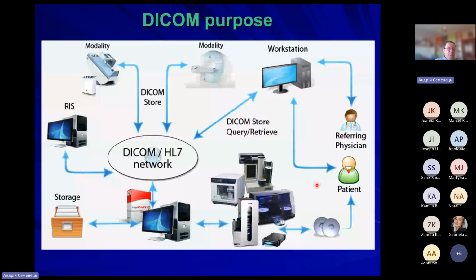And actually, DICOM ensures that no matter which vendor we choose to buy our diagnostic equipment from, no matter which model we use, they all must be compatible.